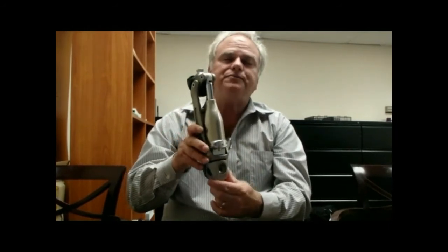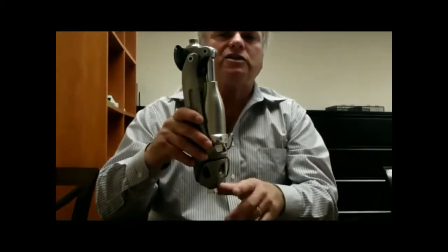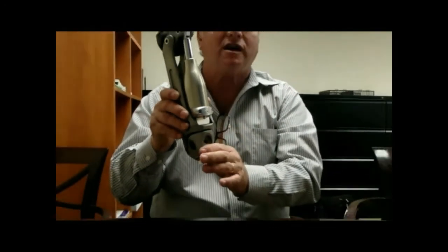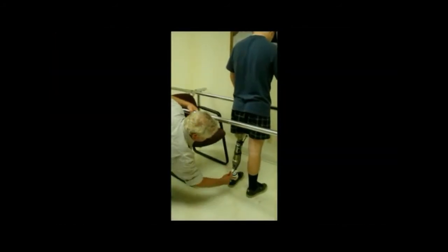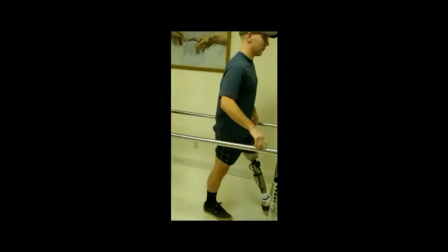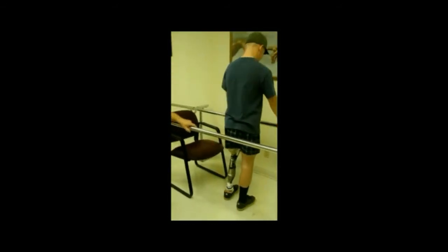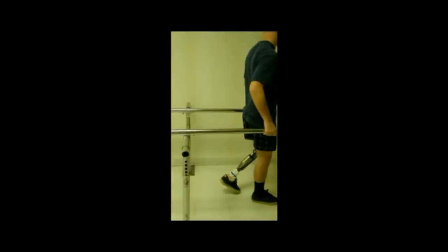Once you figure that out, if you have some motion down here and you can see it and feel it, and the patient will feel it, you've backed this off too far. Simply bring it in until the urethane's in contact and you won't have that slop. Okay. Yeah. You can feel the difference when it's easy to release. You don't have to think about it. It just releases. You don't want them to work so hard to release it.